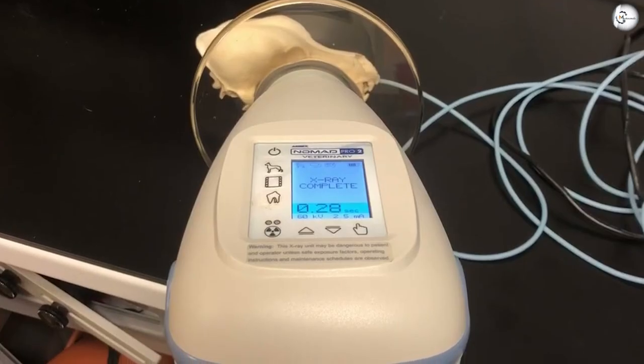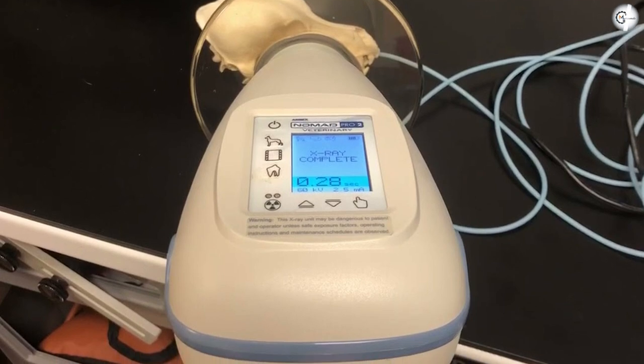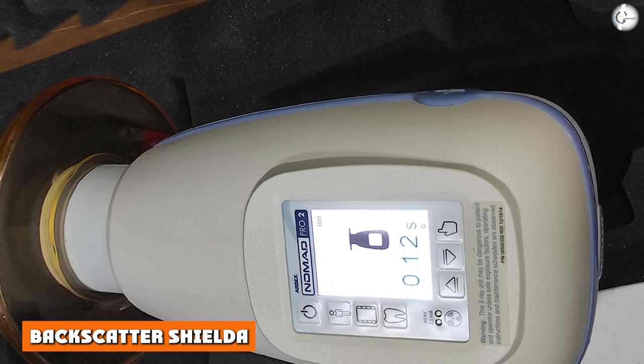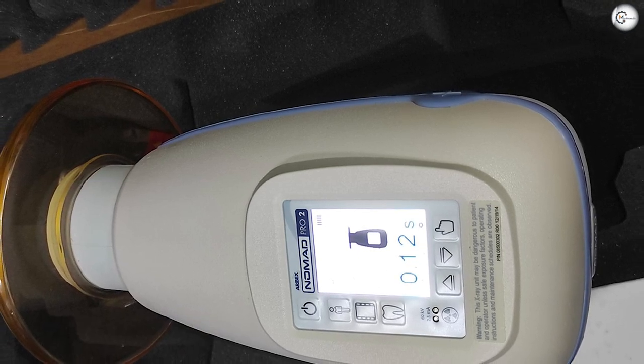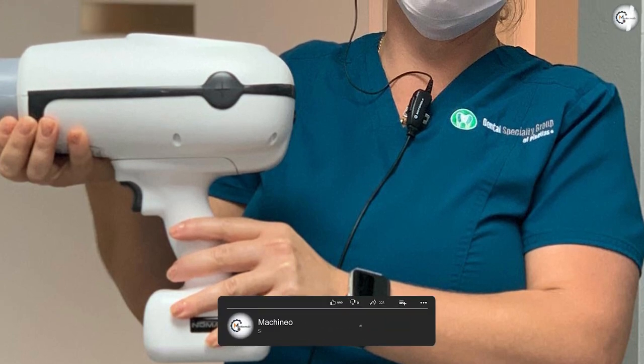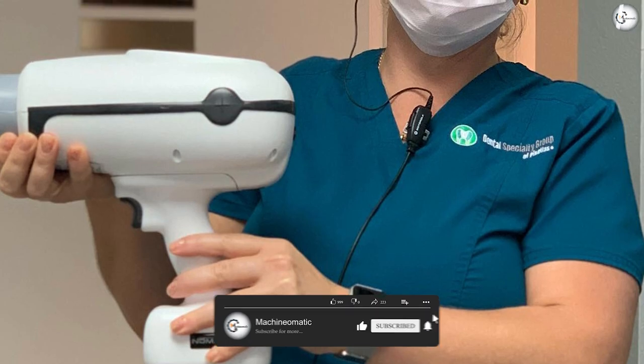The X-ray tube and collimator are completely enclosed in a proprietary blend of metals designed to block radiation leakage. Backscatter shield: most of the low-dose radiation generated by the Nomad Pro 2 will be absorbed by the patient, but in the case of backscatter radiation, the lead and polymer shield at the front of the device provides the operator with a zone of protection.